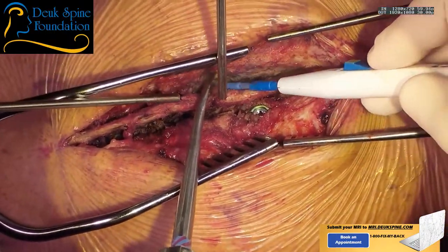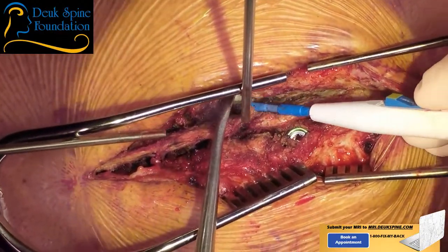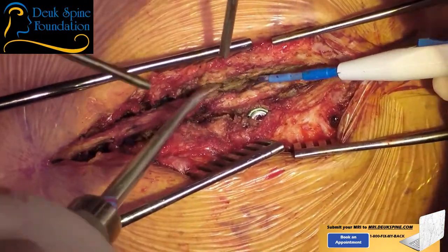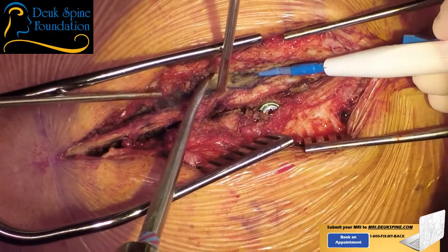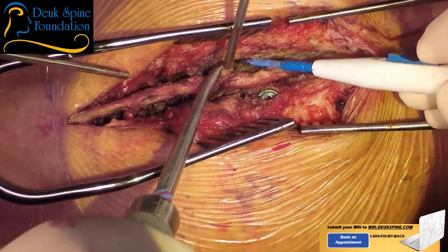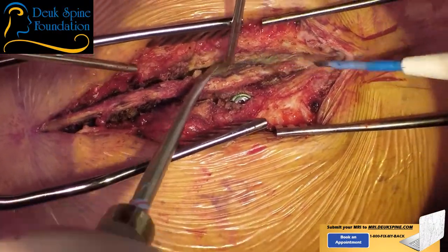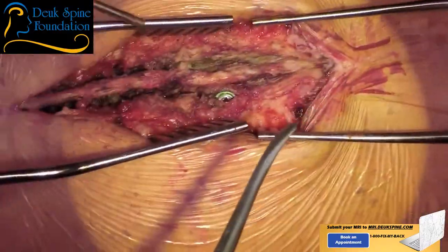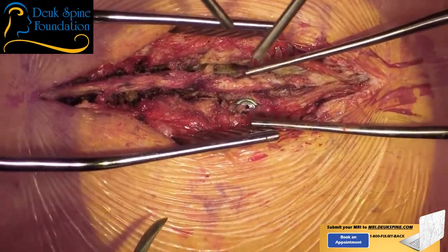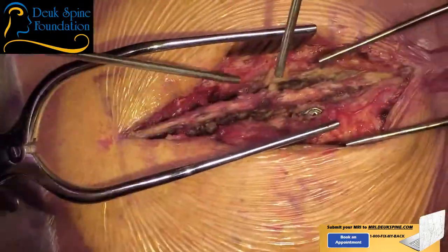So surgeons that do spine surgery have usually three goals. Decompress means get the pressure off the nerves. Reconstruct means fix the alignment of the spine. And stabilize means, you know, to make the spine stable so patients don't have pain or neurological compromise after surgery. So I am here to do a decompression, and we're not realigning and we're not stabilizing because the spine, I think, is going to be stable enough.